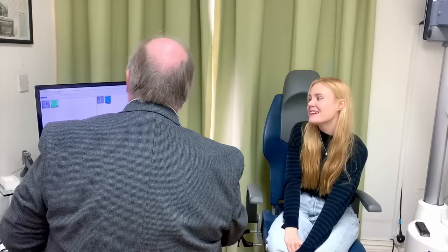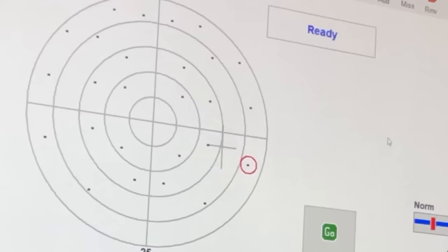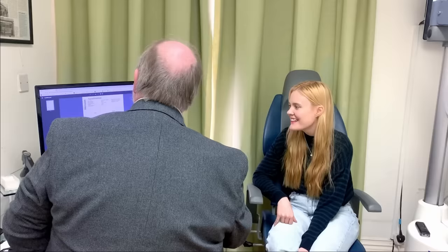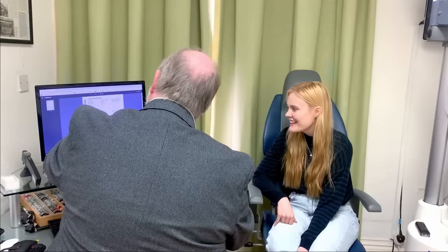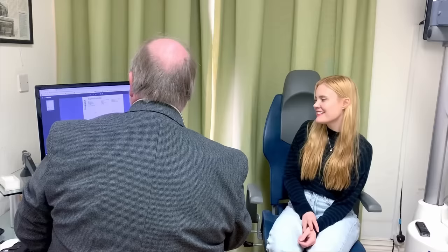Let's have a look at your field plot again. As I say, this does your peripheral vision. The square in the centre, or if you like, the target in the centre is that foveal area. We test a lot of that in here, so we know that that's working well. So what we do is fire dots into the periphery and get you to see if you can see them. And you did very well. You didn't miss any points. The background illumination is a nice level as well. Sometimes we have to increase or decrease that, and that can be a problem. But yours is looking very good. Very happy and normal.